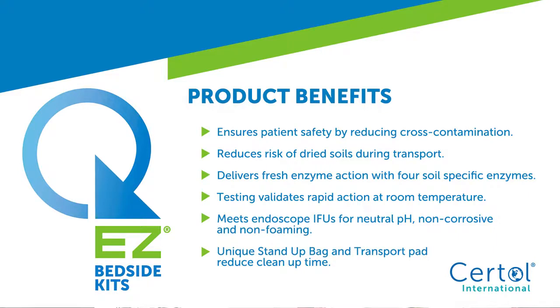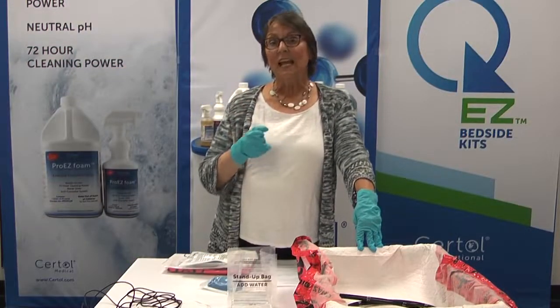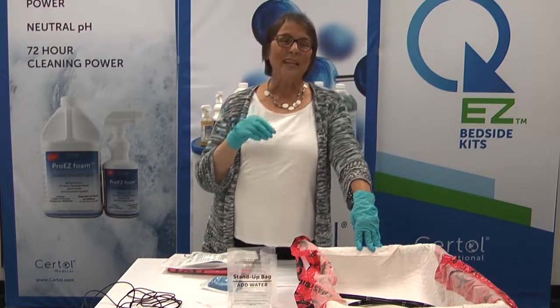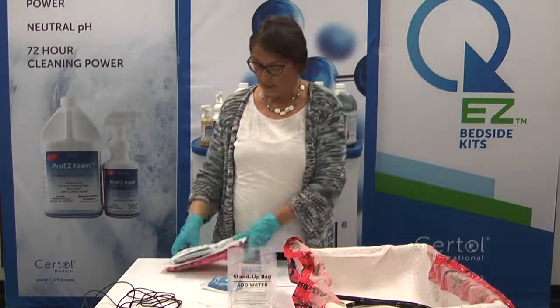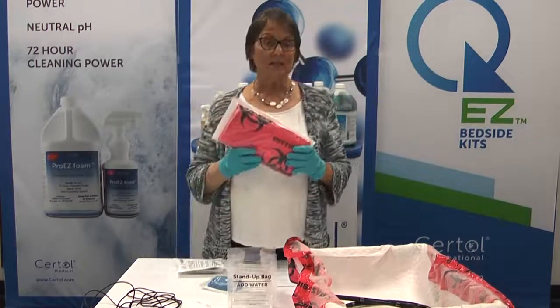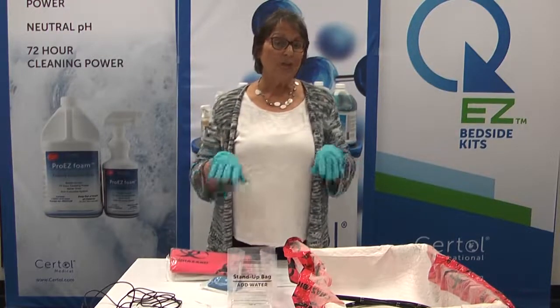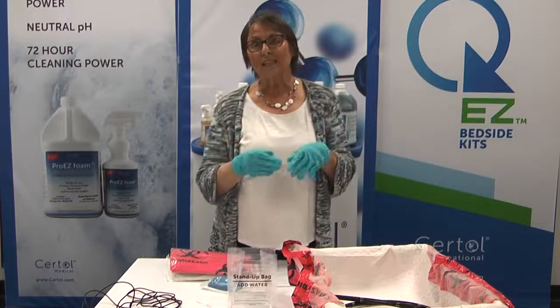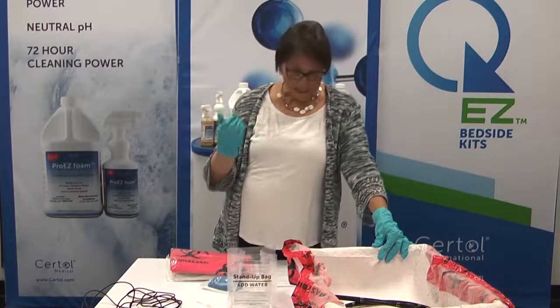It works quickly — we'll show you how it activates at room temperature and immediately provides enzymatic action. You definitely need an easy-to-use kit and you also want to control mess. There are dribbles during the procedure and definitely dribbles during cleaning. We also have a transport pad included with one kit choice that can be used as a table cover and a liner inside a rigid container — very helpful to reduce cleanup time after a procedure.